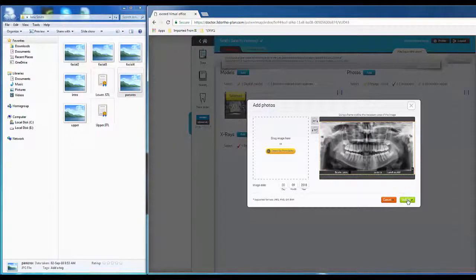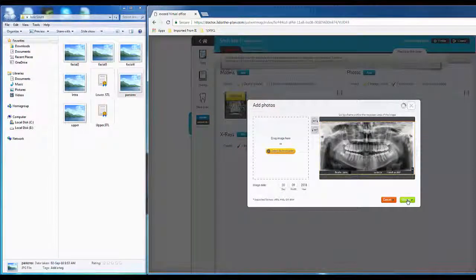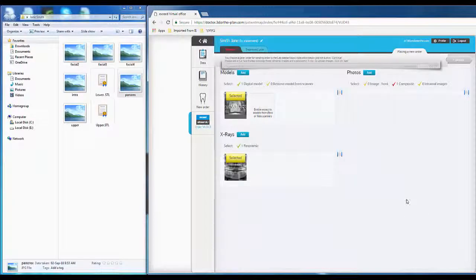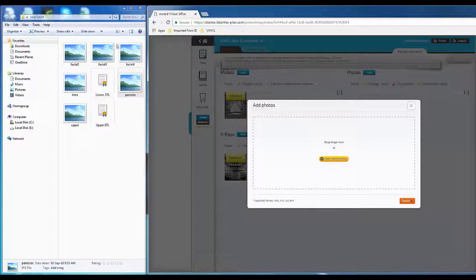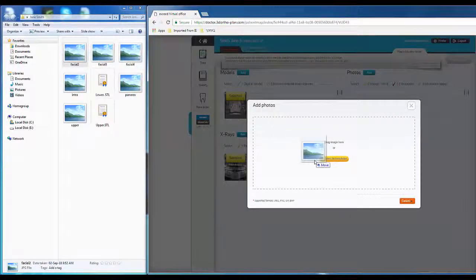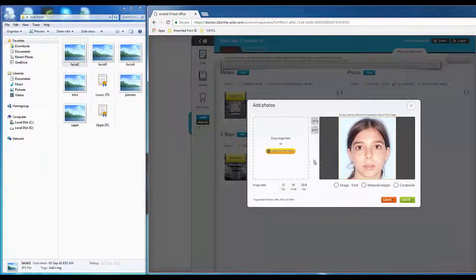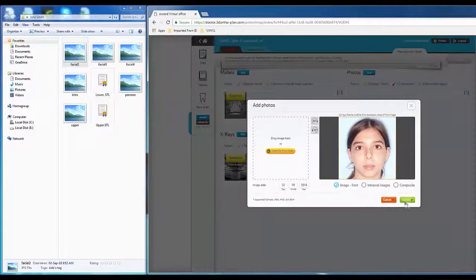Next, facial and intraoral images as well as a panoramic X-ray are needed. Drag and drop the files and then ensure they are cropped and labeled properly.